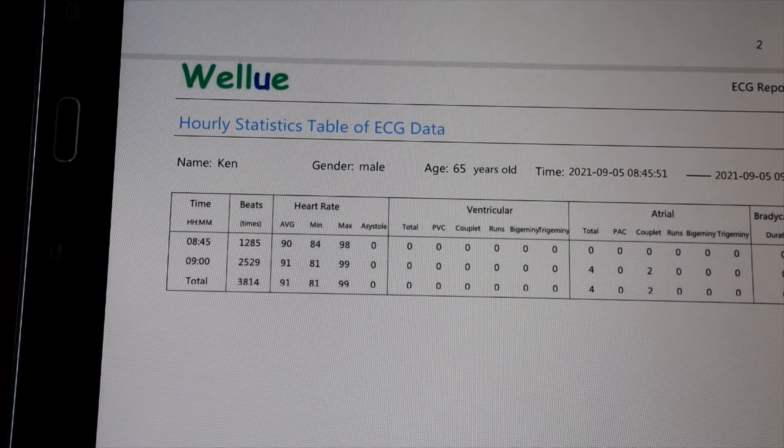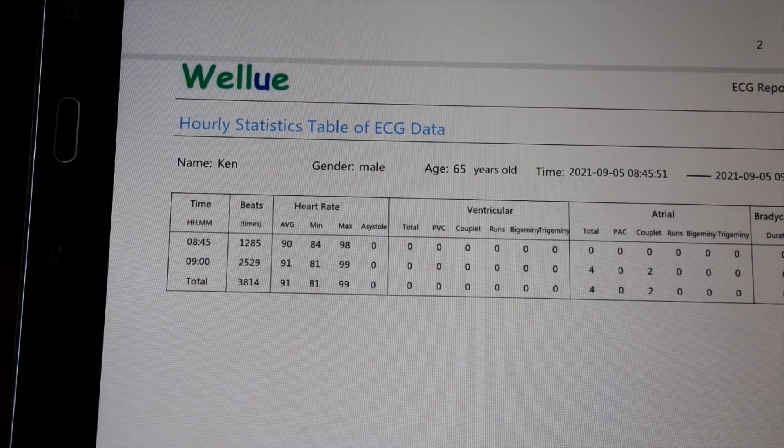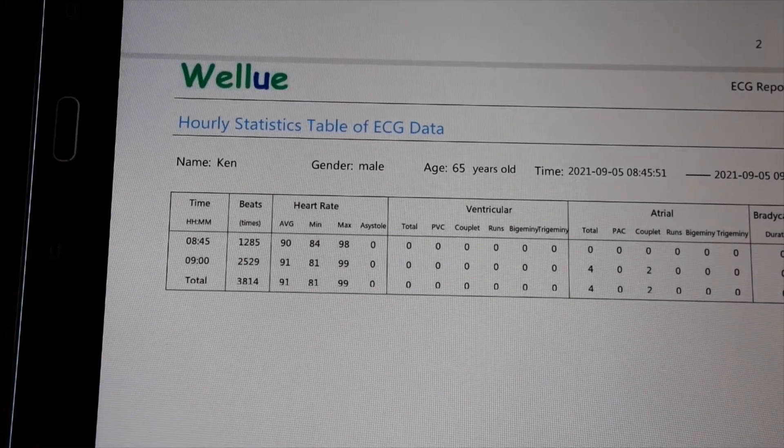You download the data to the app, then tell it to analyze and it'll do that. This one was about a 45-minute walk and it took maybe three minutes to analyze it.